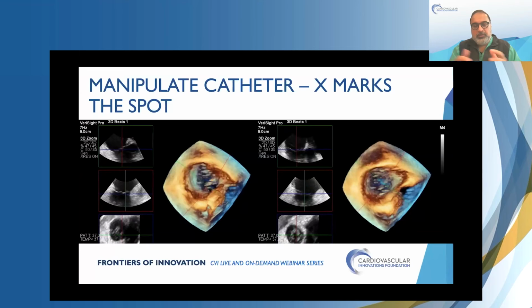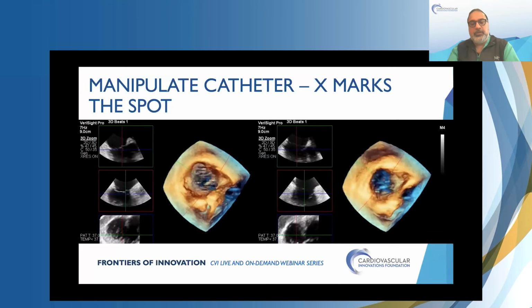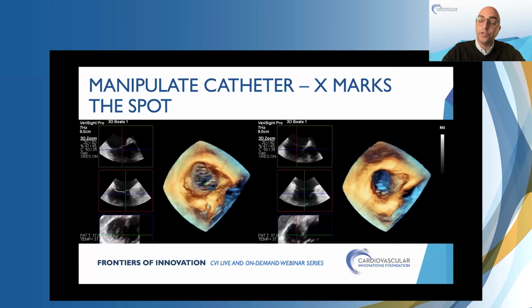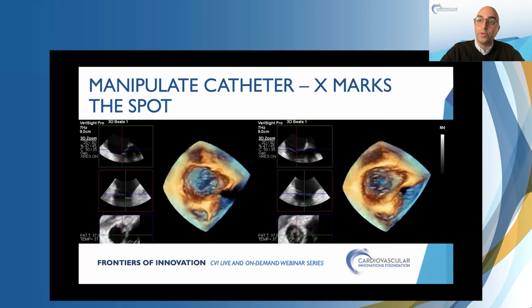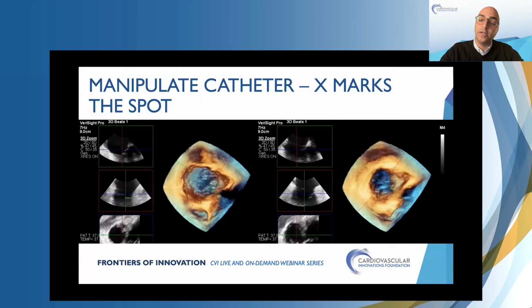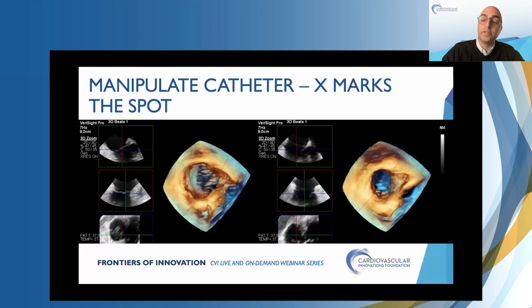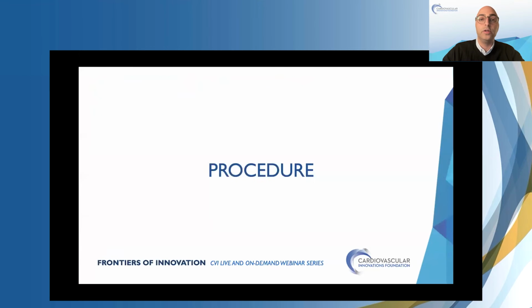And you and I would talk out loud as to how we would get the crosshairs there, if we're looking for SA mid or SA central. Yeah, and this is a good case, Gagan, where the red plane represents 45. Despite the maneuvering, we really couldn't get to a perfect grasp view for 45. So we decided we're going to utilize tilt elevation and understand the angles. And we're going to go over that in a second here. So Gagan's manipulating the catheter here, looking at it, just like Lynne showed very beautifully.